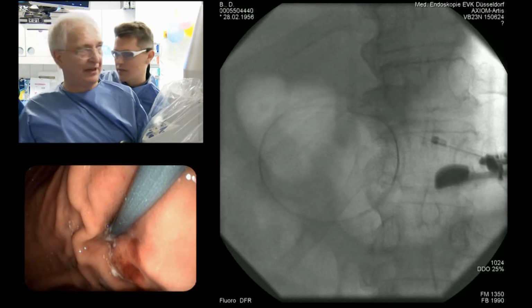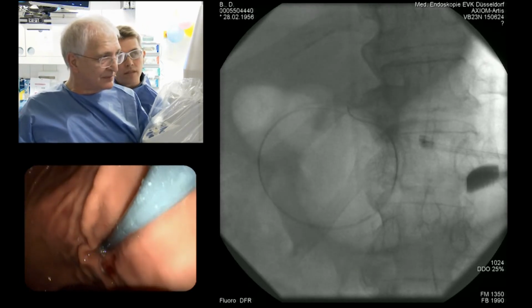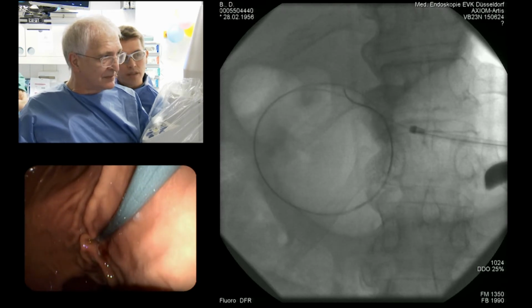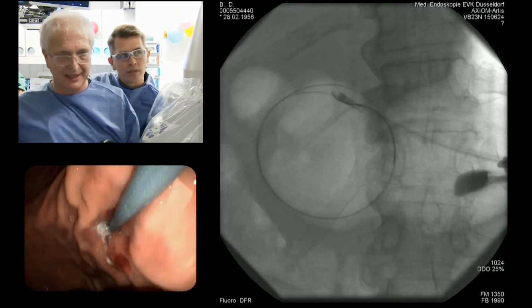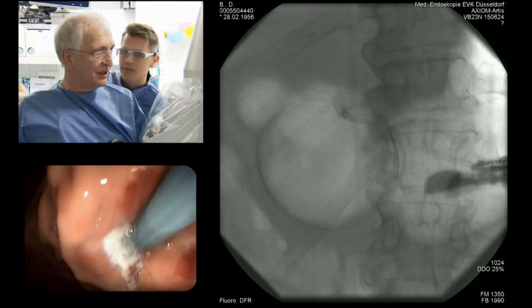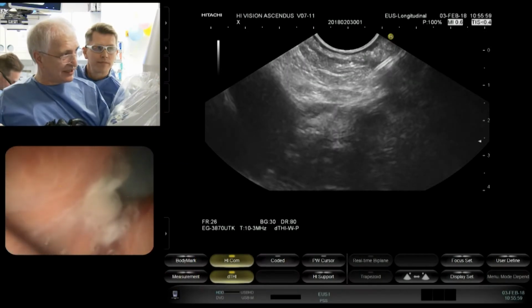We are at effect 8. Yeah. Mm-hmm. Yeah. No, we must definitely, yes, now it's going better. Now we are inside. Excellent. So it's good. X-ray, please. Now we will place a second wire there. Okay, this is the second wire.